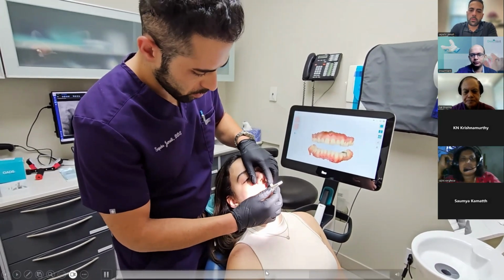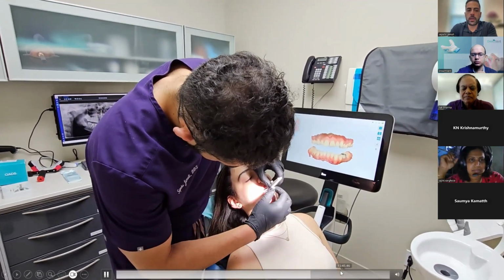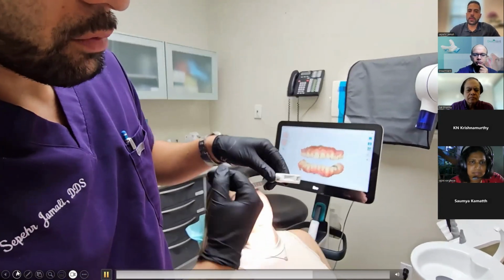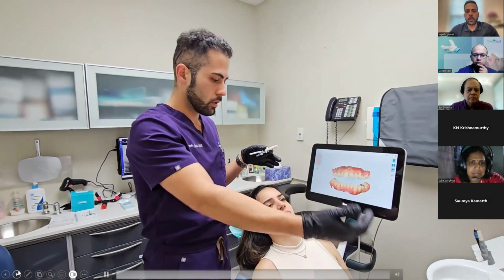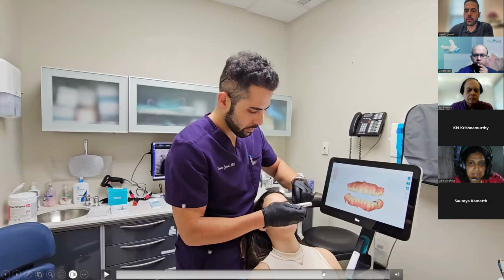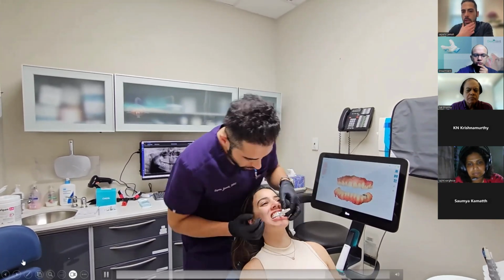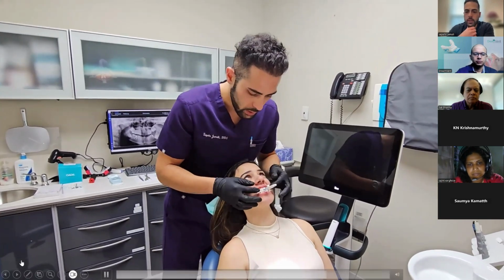Exactly. Because not all patients are gonna need it, but you're gonna see that for patients with severe class 2 or class 3 malocclusions it is better to check their maximum protrusion, maximum retrusion. And the gold standard these days is we're gonna put them at 60% of the maximum protrusion for the starting point. And with all the different bands that we have during the titration phase, we can exactly hone in on the perfect amount of protrusion for the patient, so that they are getting the benefit of improving their sleep, not just the snoring, improving their symptoms. And also there is no extra strain or pressure on the jaw muscles and TMJ that is not getting resolved a few hours after they wake up.